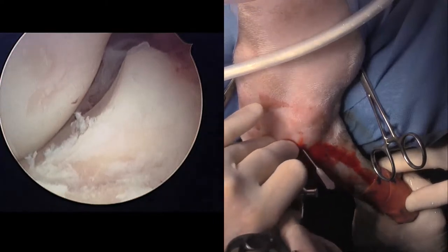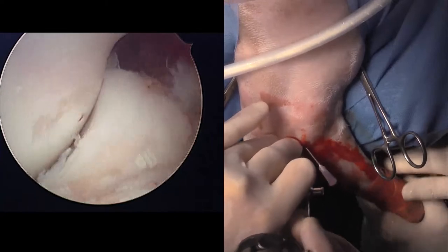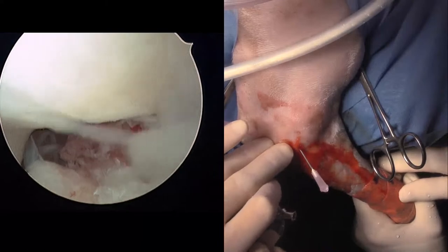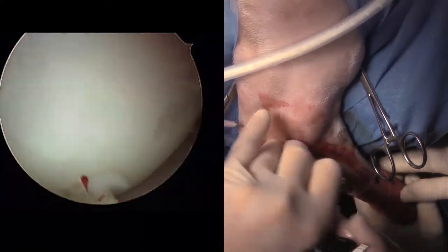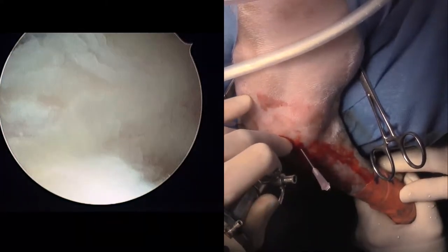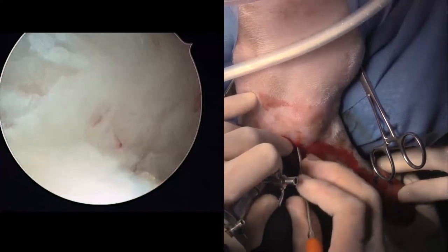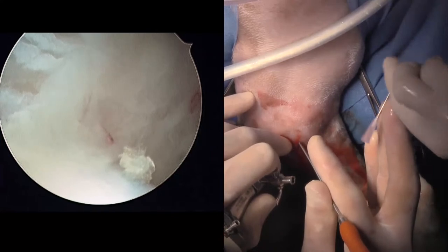So that's, again, radial head. Give the radius a turn so you can see how that's rotating there. And then that's humeral condyle there. That's the medial condyle, lateral condyle coming up to the anconeus right there. There's my egress needle. And I'm just going to grab a curette and just scrape a little bit of this tissue out. Can you grab that needle for me, please?